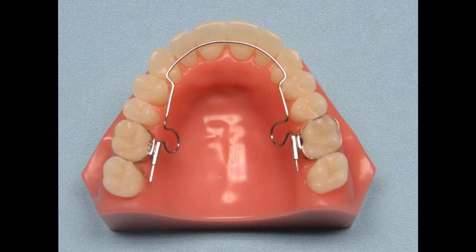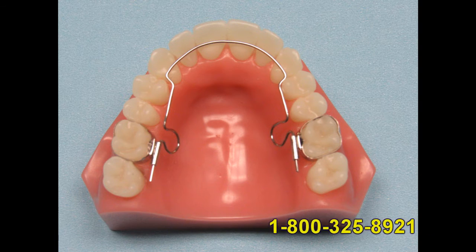This appliance is very easy for the patient to wear and tolerate. As you can see, there is nothing in the palate to affect their speech. It is very hygienic and easy for the patient to keep clean. It is also very aesthetic — nothing is visible and no one will be able to tell that the patient is wearing any type of appliance.